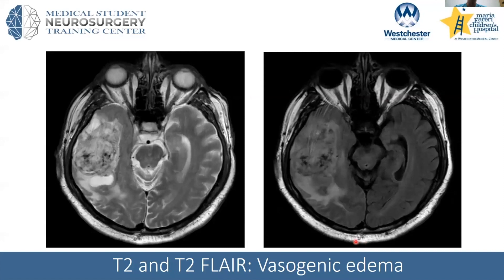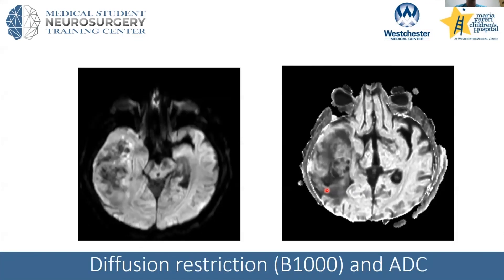T2 and T2 FLAIR are also good at picking up water. Here we see vasogenic edema — swelling and water in the brain caused by a sizable tumor. The tumor's abnormal blood vessels leak fluid, which you can pick up on MRI and, more faintly, on CT. Another commonly used sequence is diffusion restriction, usually labeled as b1000. It's very good for looking at strokes and dense lesions — high-grade tumors like medulloblastoma, where cells are tightly packed, appear bright on diffusion restriction.